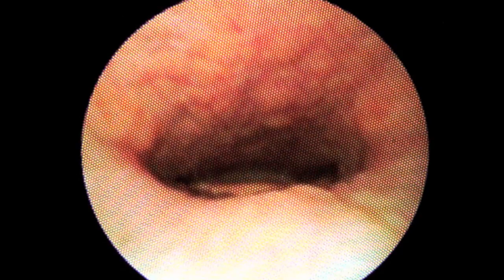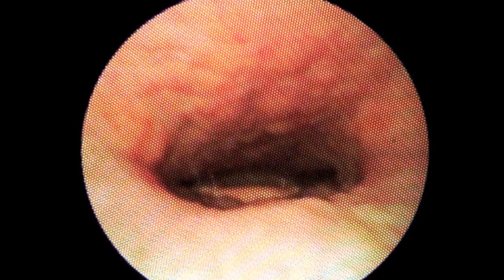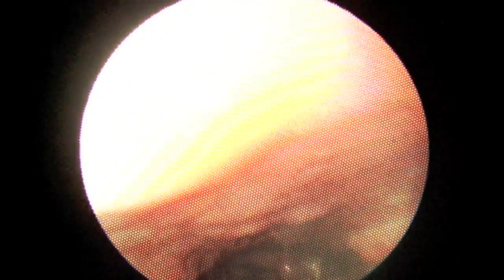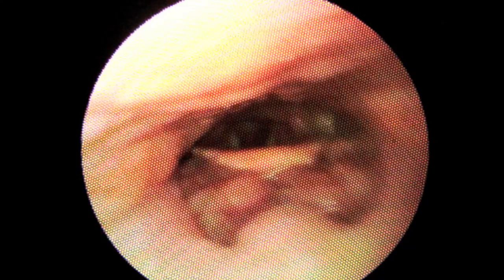We continue advancing the scope to see the base of tongue resting on the epiglottis.